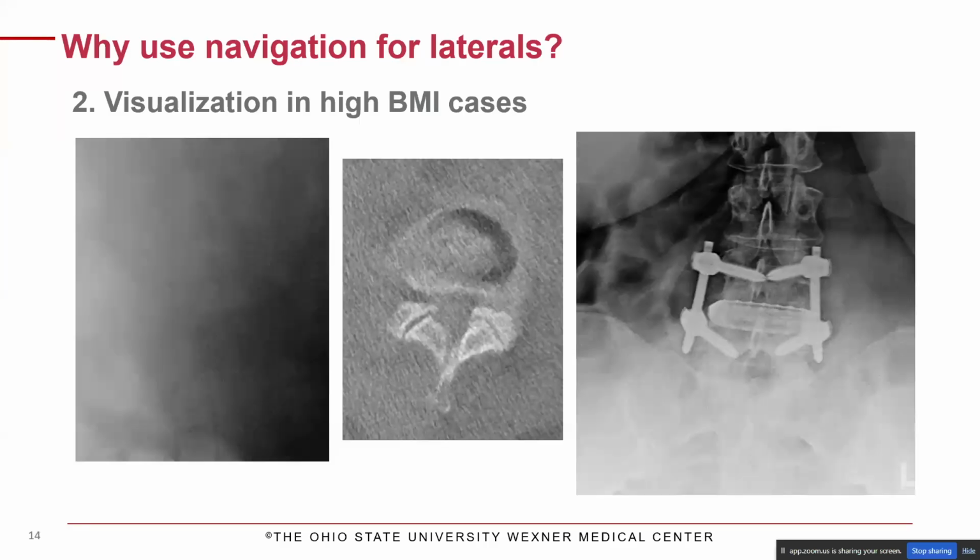So we then took a spin with the 3D imaging system, and that did allow decent visualization of the vertebra, and then finally placement of the L-lift cage and perc screws.